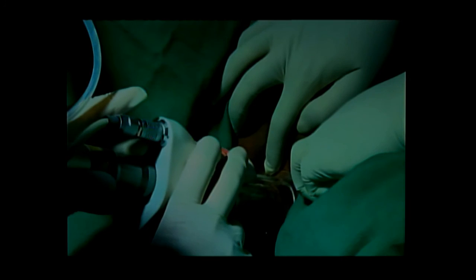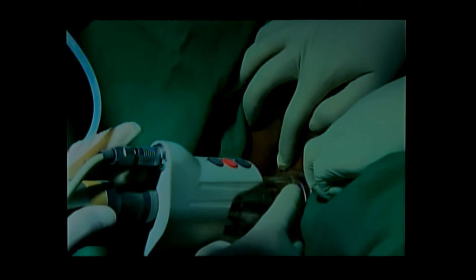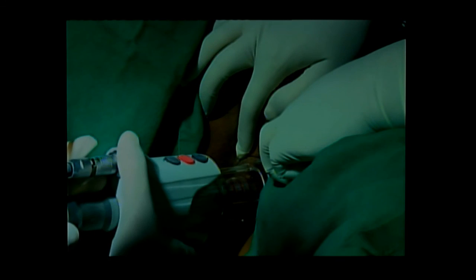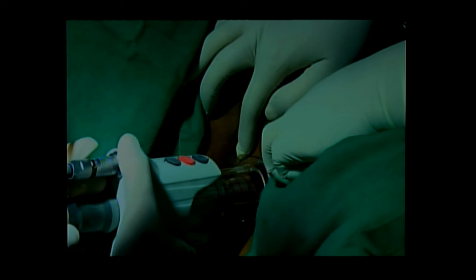And now we start. I put the pedal, if you see there's a pedal down below, and as long as I push the pedal with my foot, the laser machine continues to rotate and pull backward. So the probe has started firing? Already started. As you can see, it is rotating. First it goes in the anti-clockwise direction, and then it goes in the clockwise direction inside. You can see it lasing.